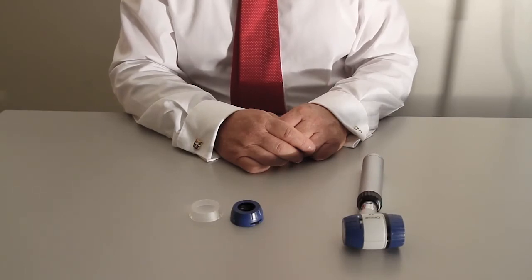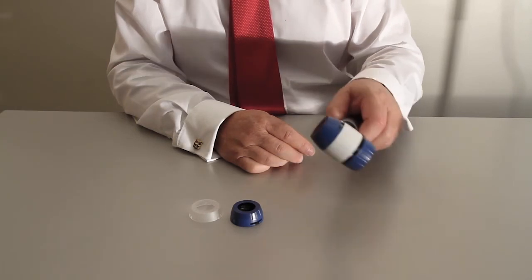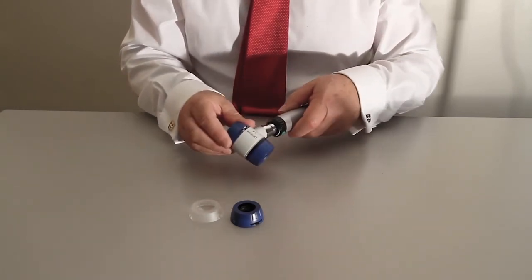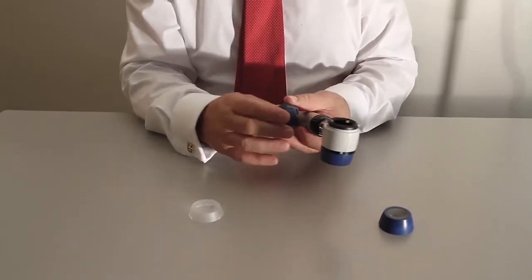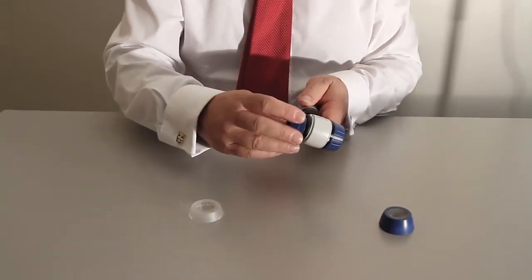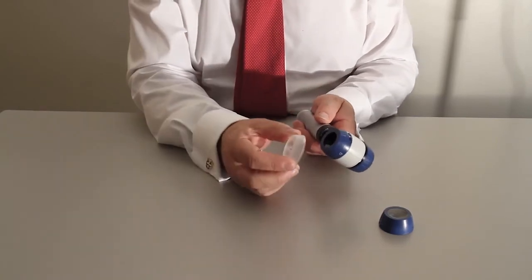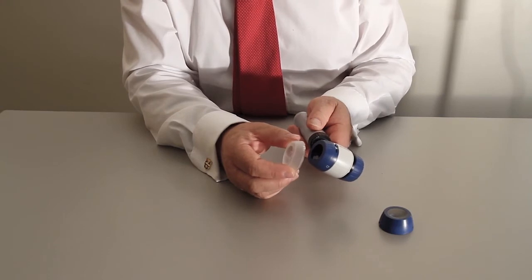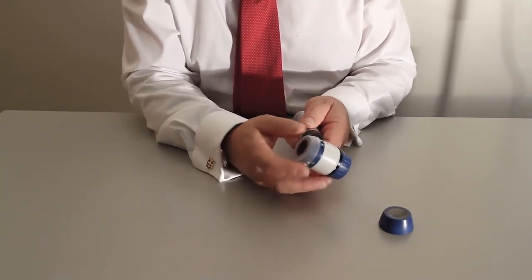A really nice feature of the Opticlar is this disposable lens cover. Just in the same way, you can remove that. We have this lens cover, which has a gap there, but the lens at the base, and that can fit on here just in the same way. Your Opticlar would have come with about 10 of these in the box, and it just clicks on like that.